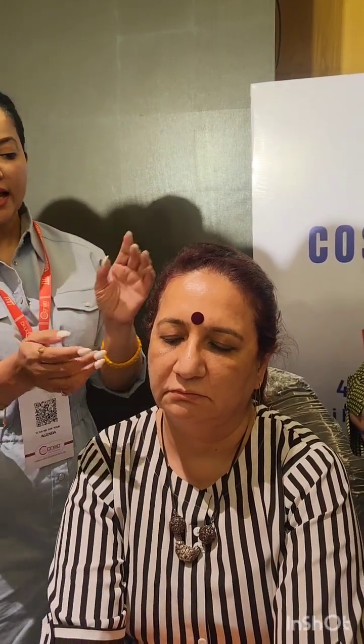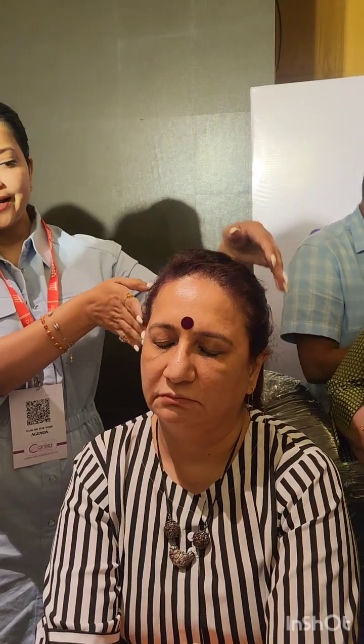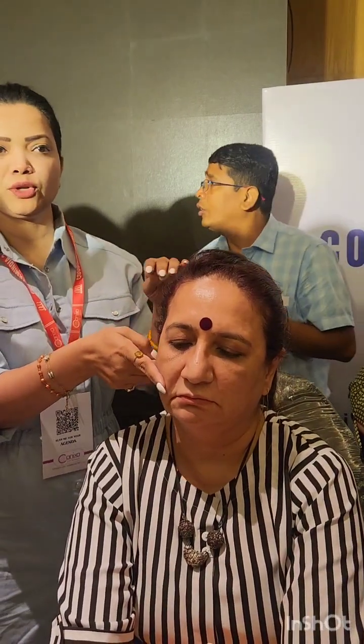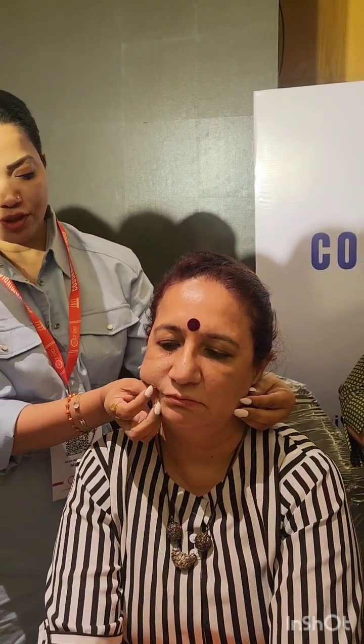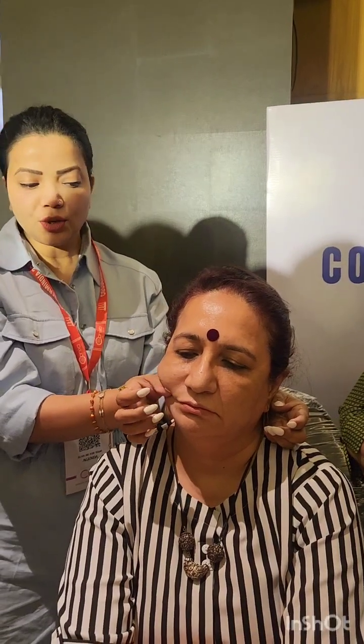I would like to correct one thing. People were saying that you cannot give volume with threads. If you are going very superficial, like superficial fat pad, then it will give just the lifting effect. But if you are going deep subcutaneous tissue, this will reposition the fat. So are you creating the volume? Are you thinning down the face? Yes, you are. So you can create. It's the technique you are using.